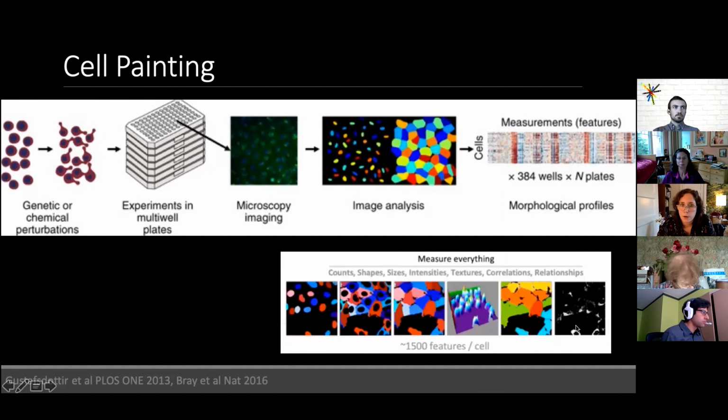When you look across all the different features that you can isolate from individual cells, you really quickly scale up to many different features. So you can look at the intensity of staining, you can look at the relative locations of different cells to one another in complex tissues, and you can quickly start to appreciate phenotypes that you might not be able to notice qualitatively.